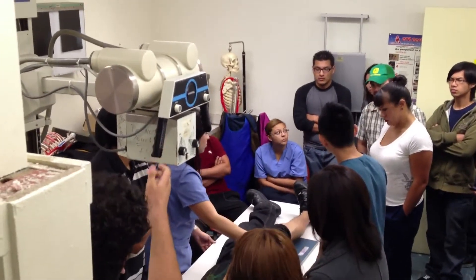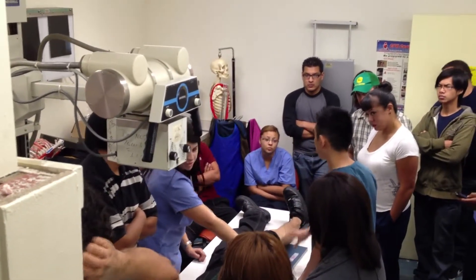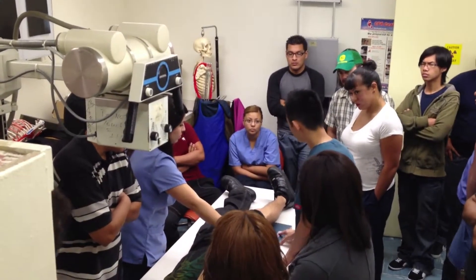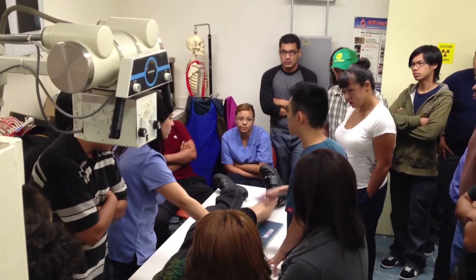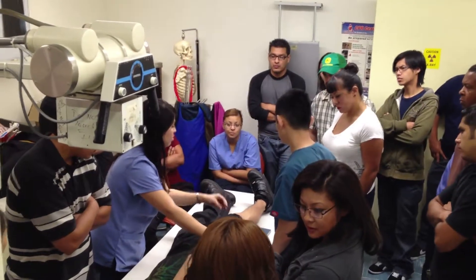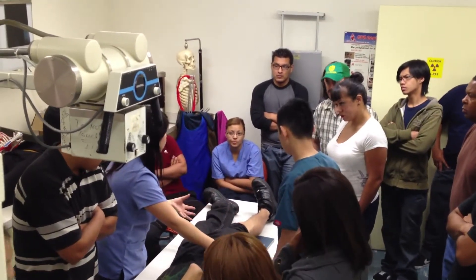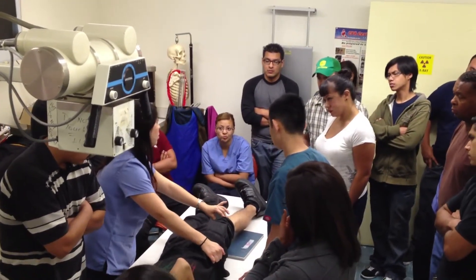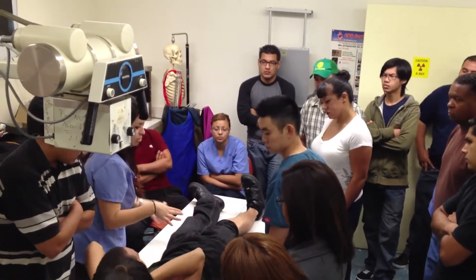Even when you do Bucky like that, it's fine. You can increase the OID, or increase the SID to make up for the OID. The OID is really not that big of a deal. Keep in mind, sometimes the thinner the patient, the less you have to turn. Sometimes with thicker patients you won't be able to see it — you think you're turned enough but you might have to turn a little bit more to get the rotation needed.